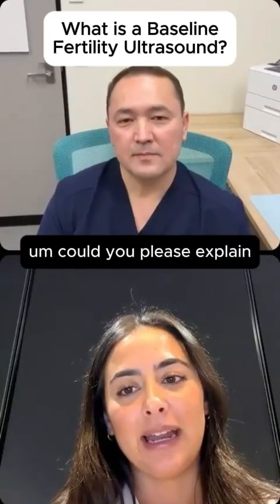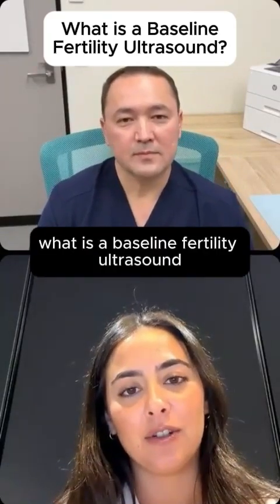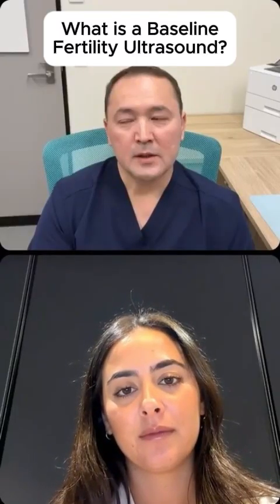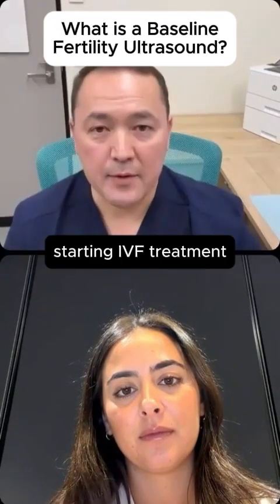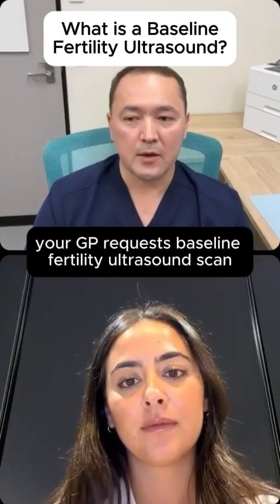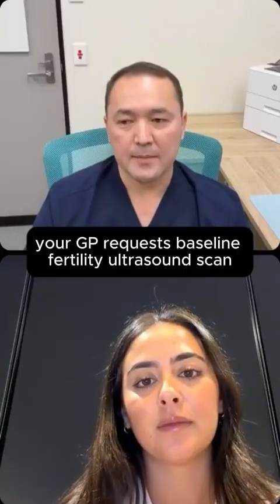Could you please explain what is a baseline fertility ultrasound? Starting IVF treatment or before you see a fertility specialist, your GP requests a baseline fertility ultrasound scan.